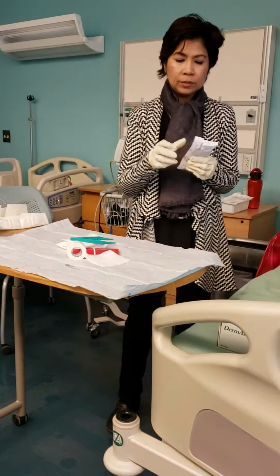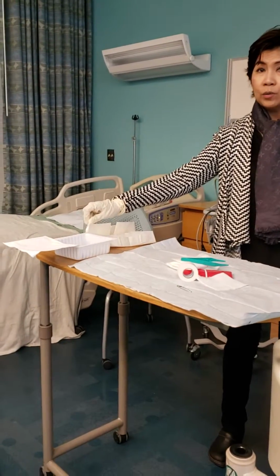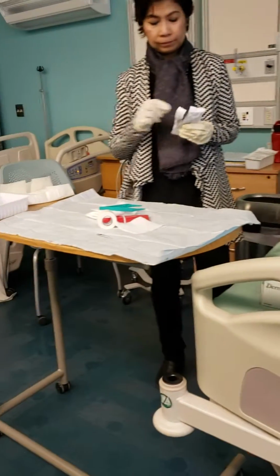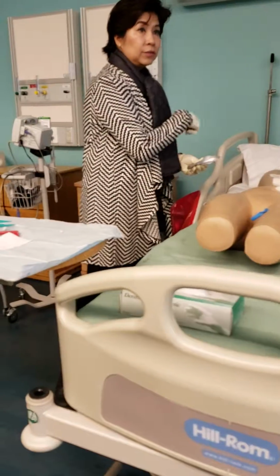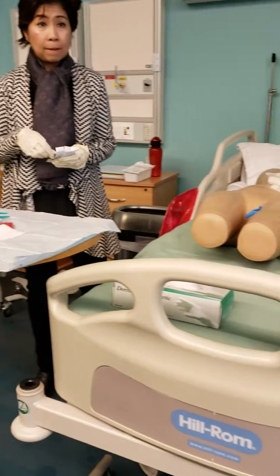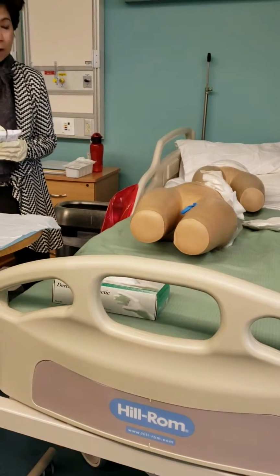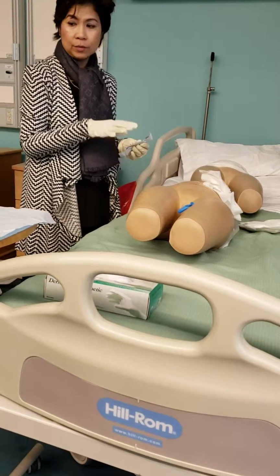If this is just a swab stick, you can just dip your swab stick here and then do the same thing. Clean and then discard. Clean and then discard, and so on and so forth. Do you want us to do the outsides of the wound first and then the inside? I would do the inside first and then the outside, from the inner outward.